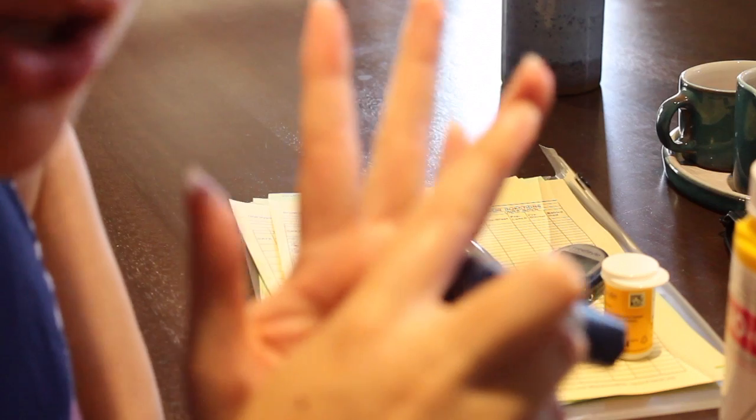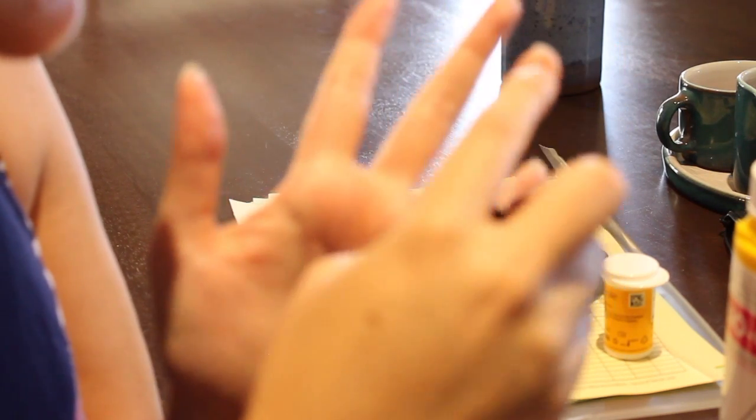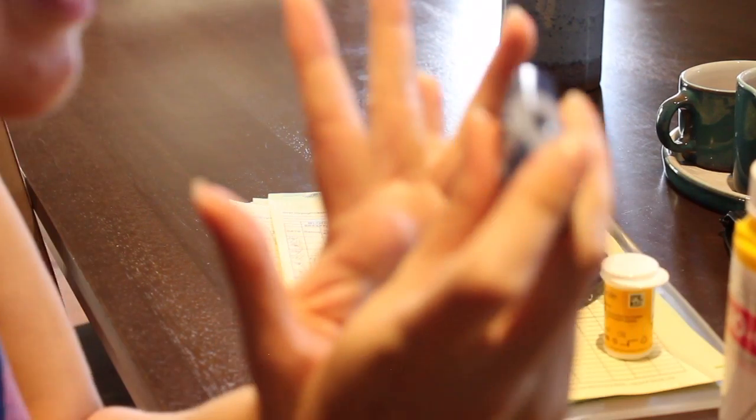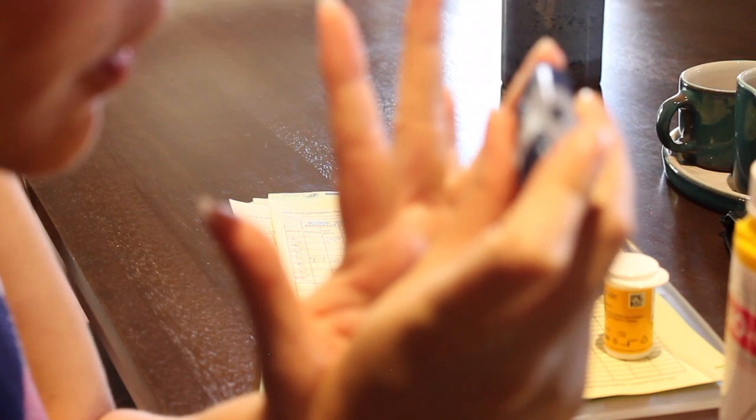Okay, so you press that up. You want to go along the side, not directly facing into the pad because it hurts more. So you want to go along the side, not too close to the nail because the bone is right there. So you still want to get some padded cushion. So press, get the hole directly there.